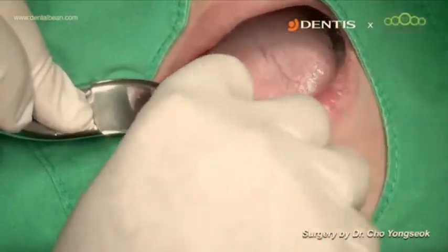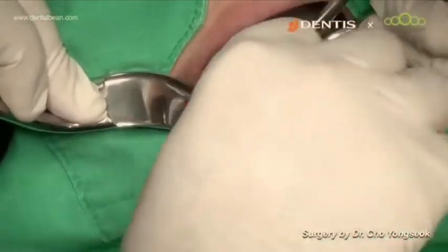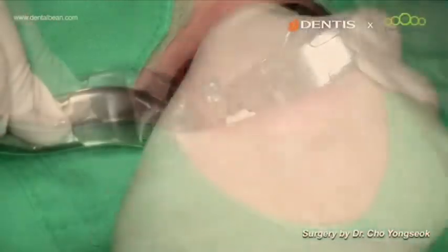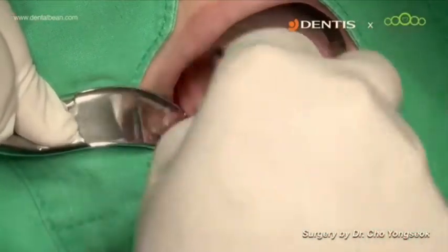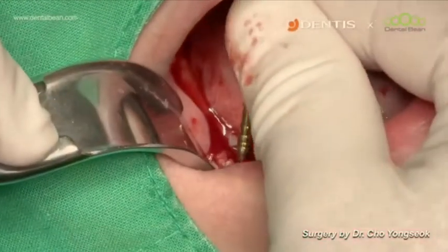The feeling is very nice when I place an XL implant because of the very sharp thread and good self-tapping ability. I can easily insert it and get strong primary stability.